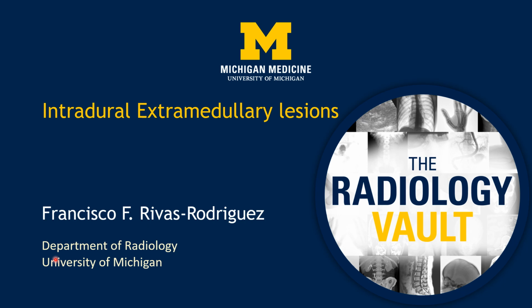Hi, my name is Francisco Rivas, and today we will talk about the imaging features of intradural extramedullary lesions.